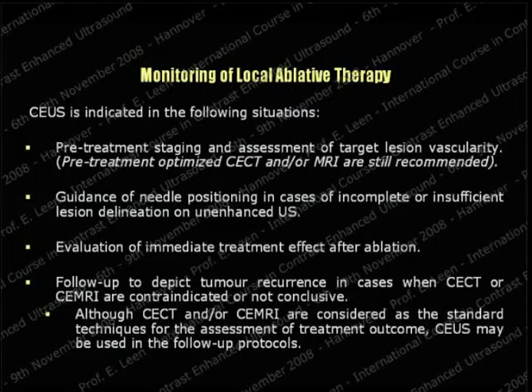Now, as you can see here, there's another sub-statement. Although CT and MR are considered the gold standard, we do recognize that CEUS, especially in the case of hepatoma monitoring, has a great value in terms of follow-up protocols.